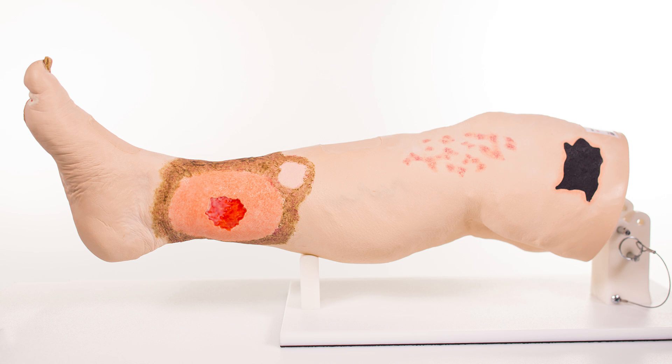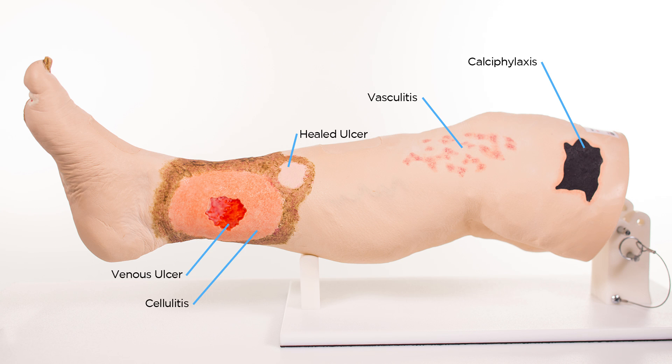On the left side of Vinnie there is calciphylaxis, vasculitis, a healed ulcer, and a venous ulcer with cellulitis and hemosiderin staining in the gaiter area.